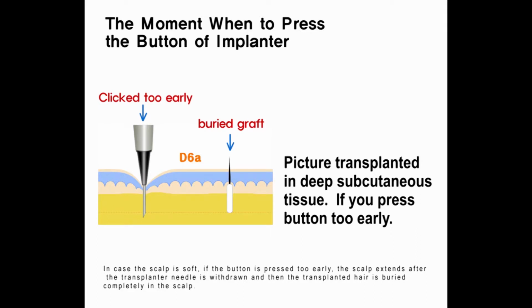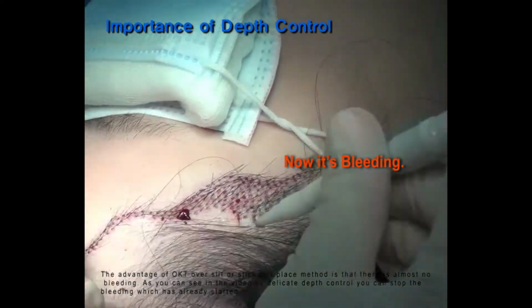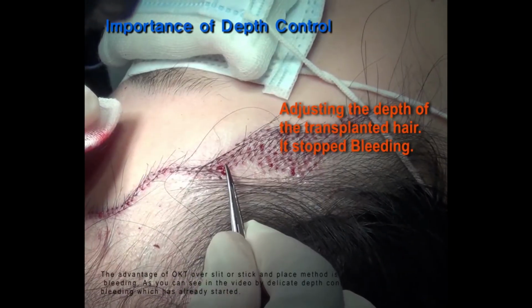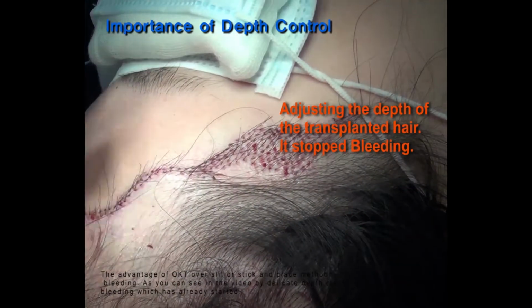In case the scalp is soft, if the button is pressed too early, the scalp extends after the transplanter needle is withdrawn, and then the transplanted hair is buried completely in the scalp. If the button is pressed too late, the hair root is exposed in the air. The advantage of OKT over the slit or stick-in-place method is that there is almost no bleeding. As you can see in the video, by delicate depth control, you can stop the bleeding which has already started.